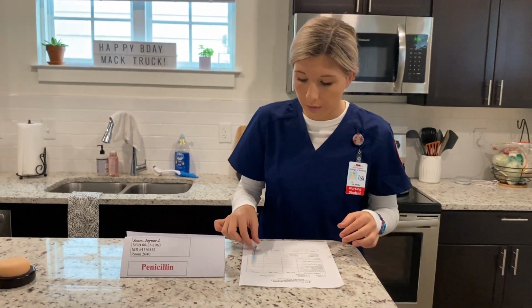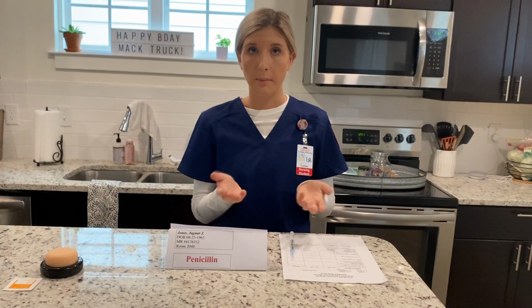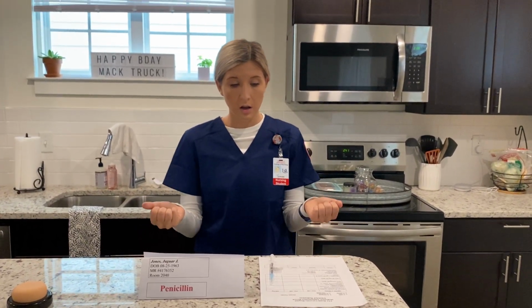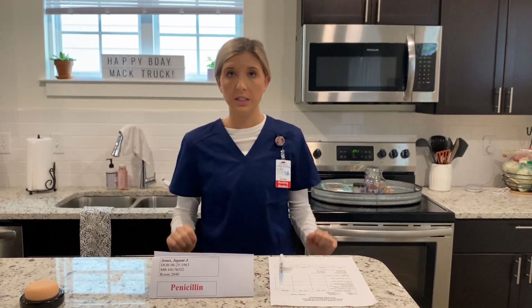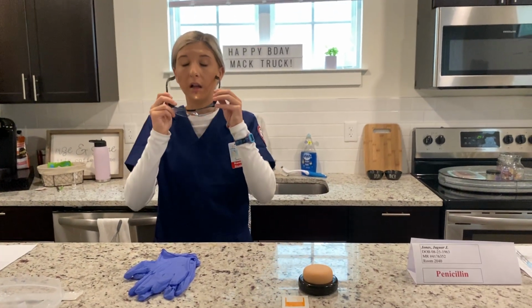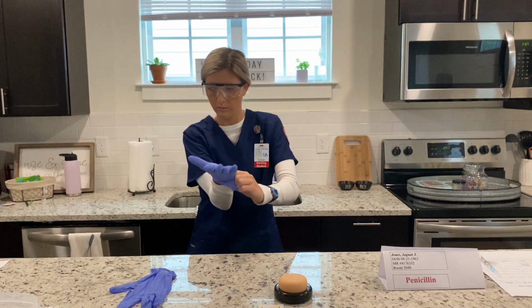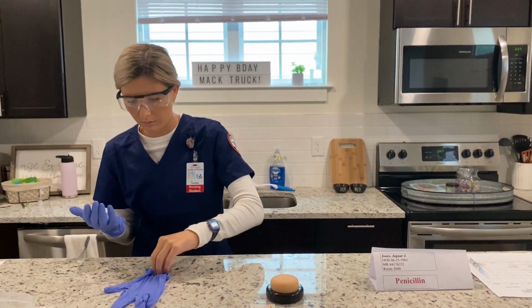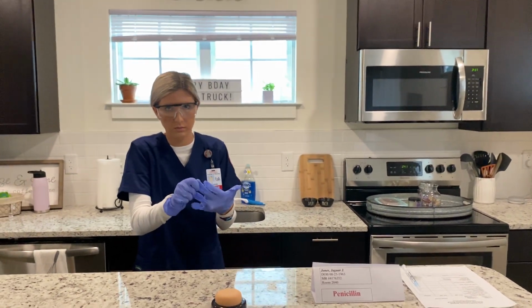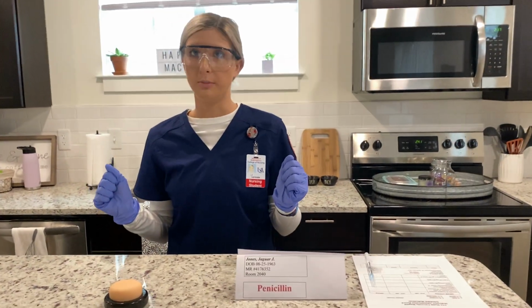And then I'm going to explain the procedure to the patient, and I'm going to let him know when I'm about to inject. And then I'm going to raise the bed to a working height and lower the side rail. And then I'm going to apply my goggles and my clean gloves. And then I'm going to assess the abdominal area.